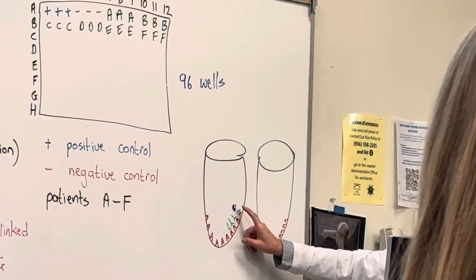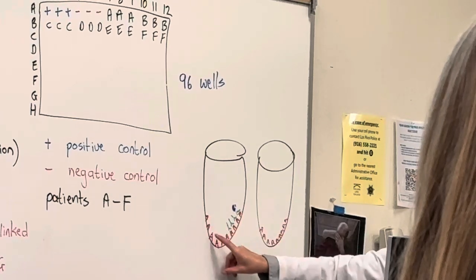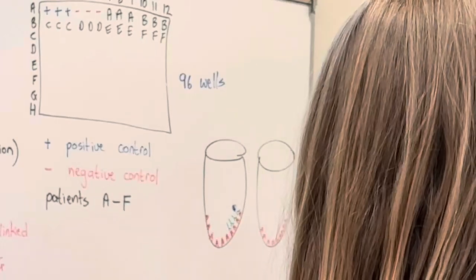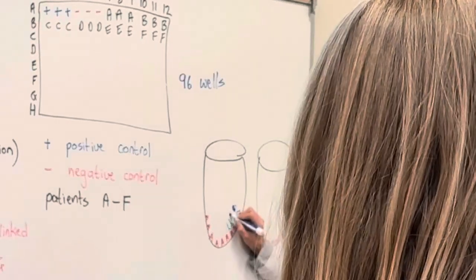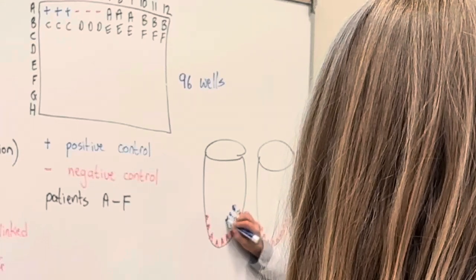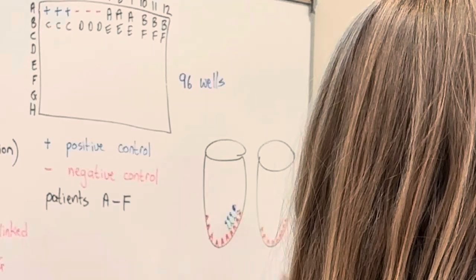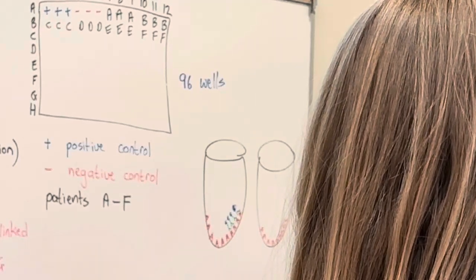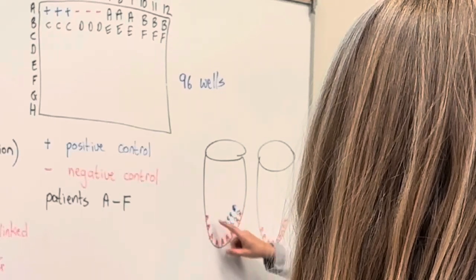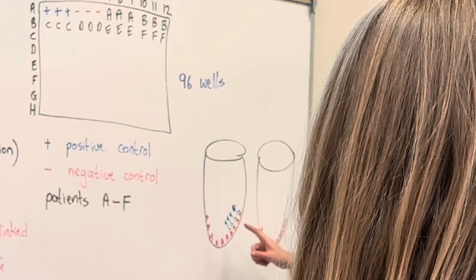Are you guys with me on that? Let me explain it one more time. Stay with me. Your patient's antibodies, we added an immunoglobulin we bought from the store. This immunoglobulin matches whatever disease we're looking for, and attached to these immunoglobulins is an enzyme. When we add the chromogen, because there's antibodies and because there's enzymes, that chromogen is going to change color, telling us our patient is positive.